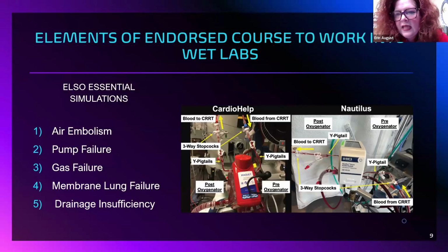So these are the ones that if you were to become an endorsed course center from ELSO, these are the ones that they require that you teach. And they also will mentor you to make sure you have all the elements of how they like their simulations and wet labs to be taught. So air embolism, we know that can come from a multitude of things.